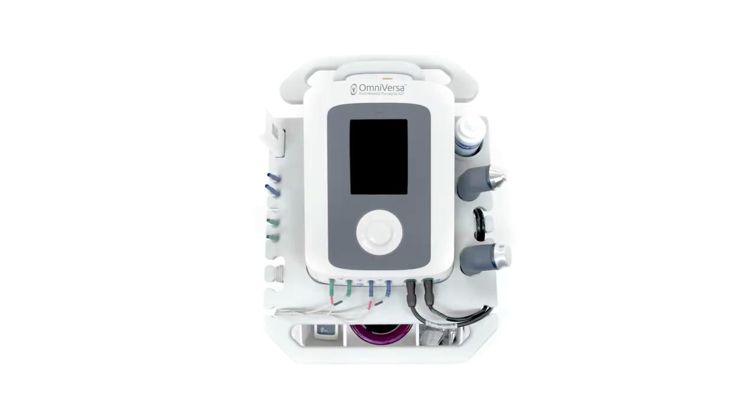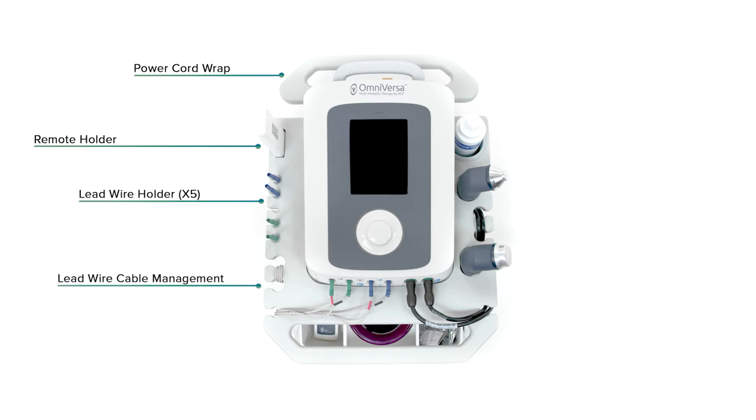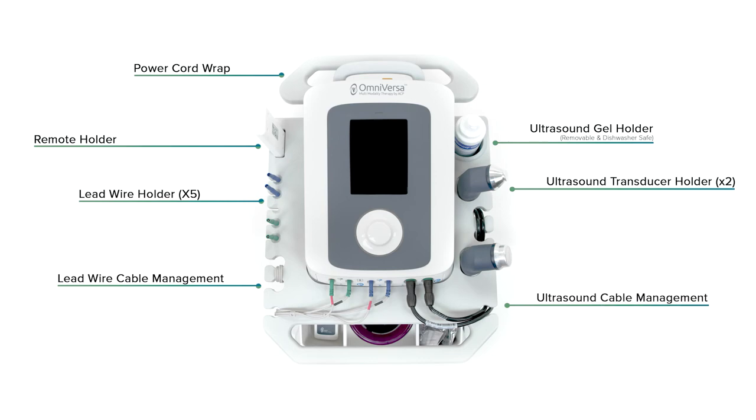These upgraded features include a power cord wrap, remote holder, lead wire holder and cable management, ultrasound gel holder and ultrasound transducer holder and cable management.